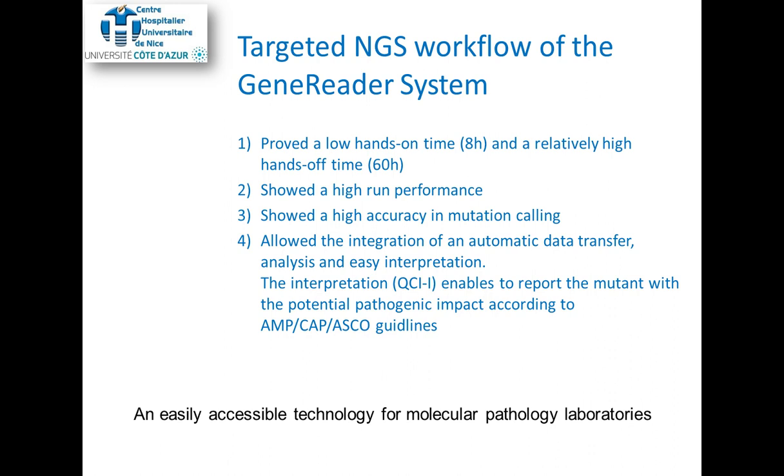So in this context, the interpretation, so the QCI, enables to report easily the mutants with a potential pathogenic impact according to the previously described CAP-ASCO guidelines. So for us, it's an easily accessible technology for all molecular pathology laboratories.